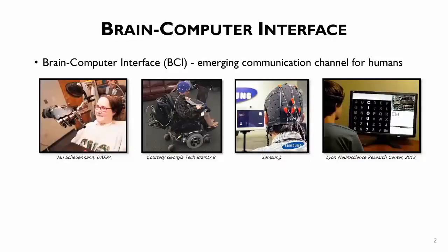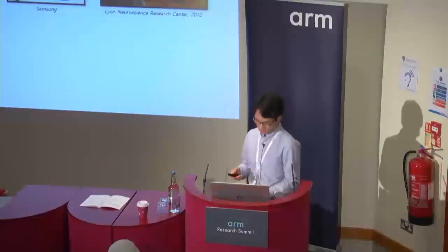So let's start with what the brain-computer interface is. BCI is an emerging communication channel for humans. These are various BCI applications, and physically or mentally disabled people may often experience inconvenience. For those, BCI technology can help them by connecting their intentions with the medical equipment.